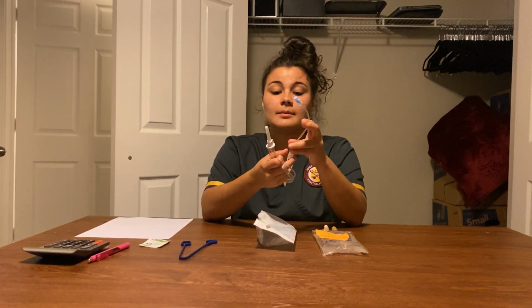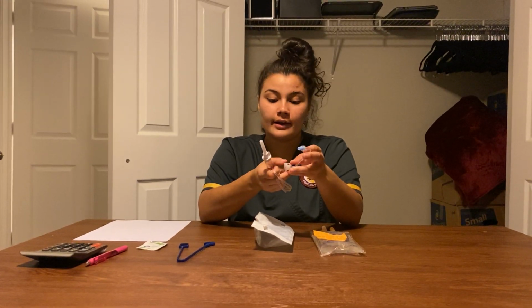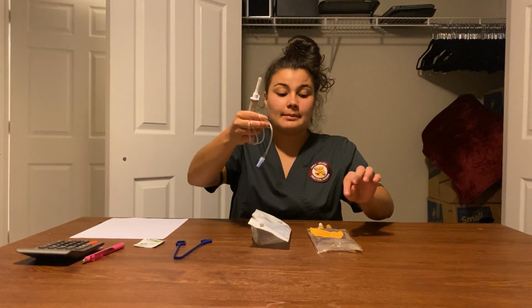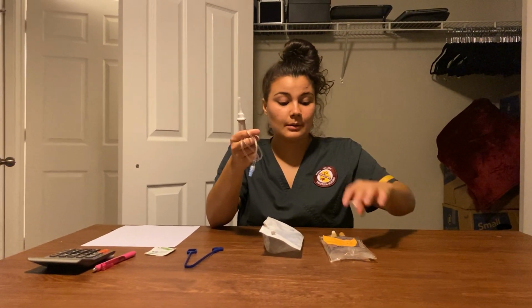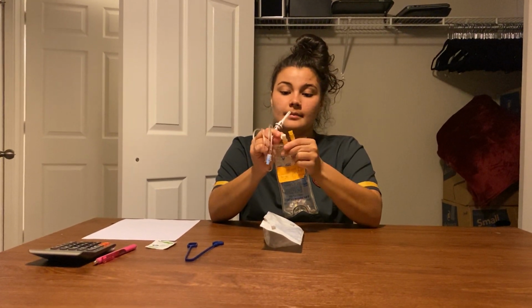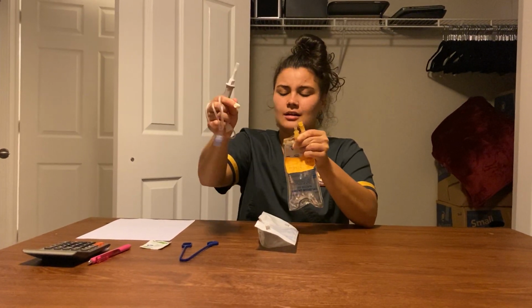Now what I'm going to do is make sure I close my regulator clamp all the way down. Now I'm going to get my medication. Try not to touch that. And I'm going to spike it. By doing this, I'm going to take this top off.